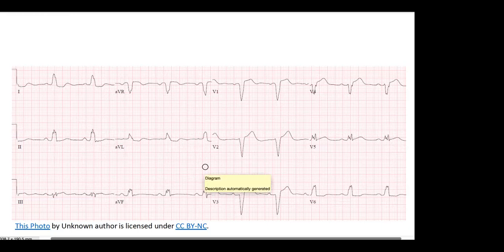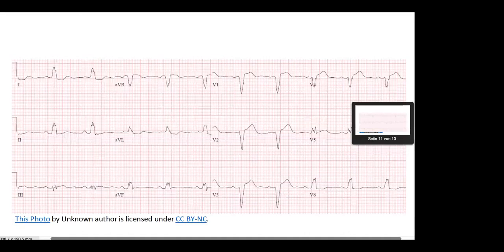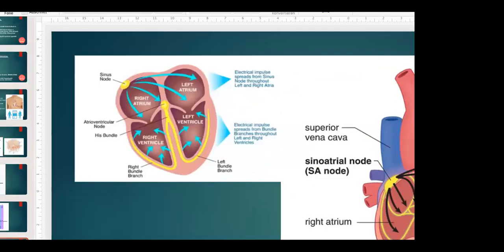Well, like I said before, I would need your help when it comes to the left bundle branch block, right bundle branch block. Could you please explain to the group why a left bundle branch block is something that should not be ignored, especially if it's appearing for the first time, and the implications and what could be behind it? Yeah, I need this to show you.